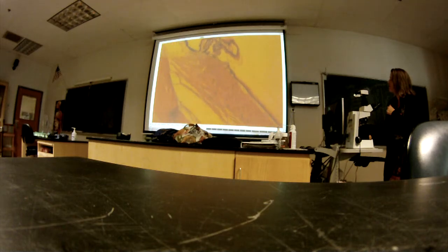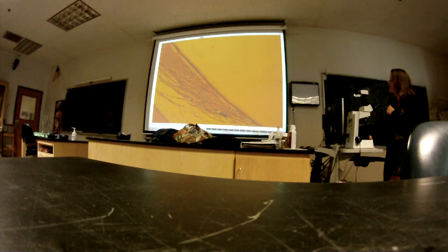You can go down the other end of it. There it is. That little strand might be the suspensory ligament. Let's see. Guess not. No, probably not. Yeah, I don't know. It almost looks like a piece of the lens that kind of unraveled, although I guess it could be. I've never seen suspensory ligaments on the slides before.